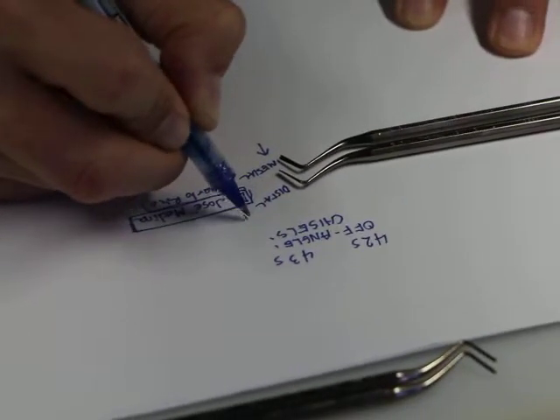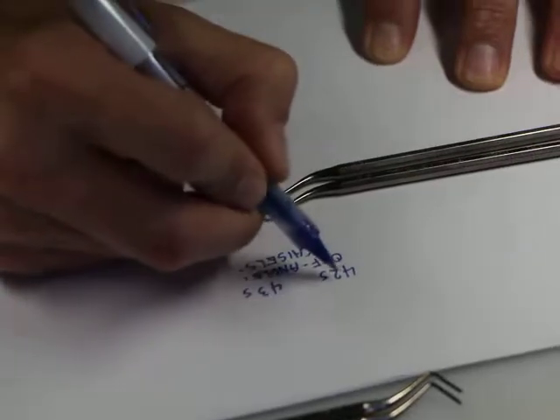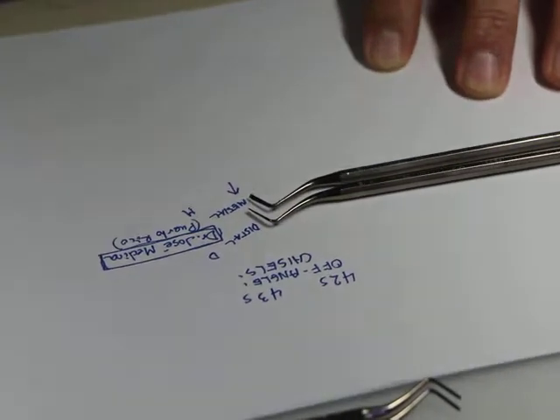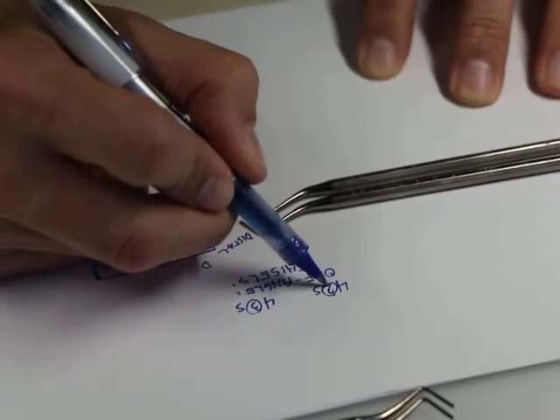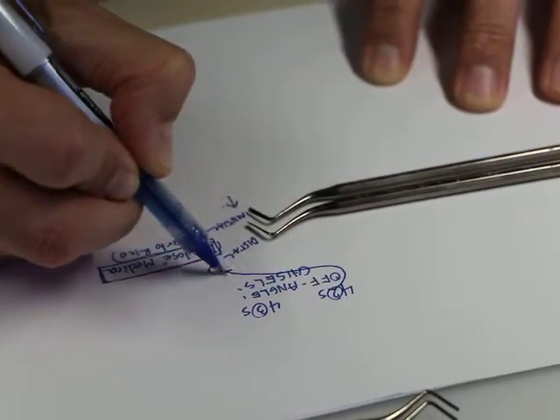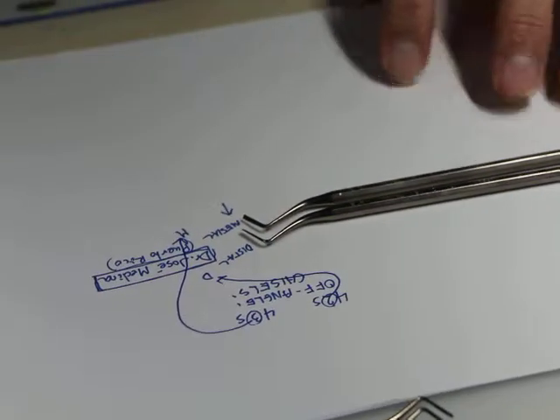Distal, the letter D comes before M in the alphabet. Agreed? And, numerically, two comes before three. So, the 42 is the distal, the 43 is the mesial. I think that's just one way to remember it.